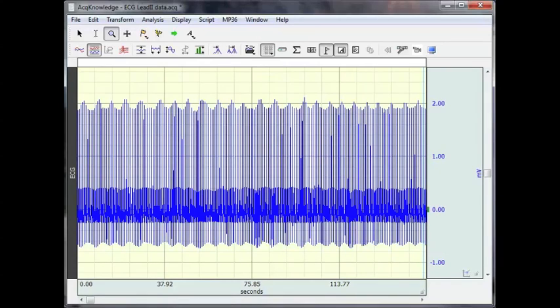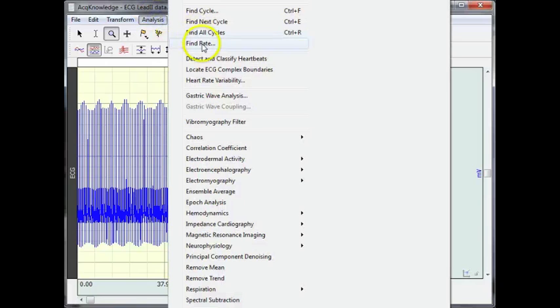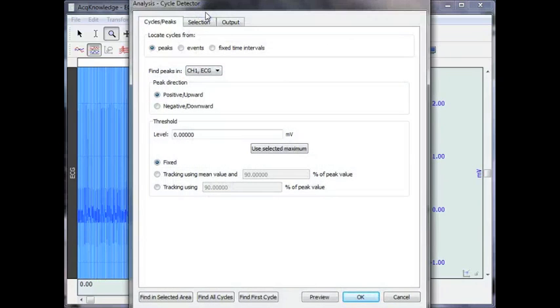The following screencast will provide you with a demonstration of Oconology's Fine Cycle Peak Detector utility. The Fine Cycle Peak Detector feature is located in the analysis menu. It's an extremely flexible tool that allows you to identify peaks or parts of waveforms, to place event markers within the data.